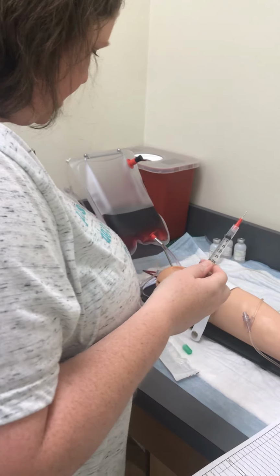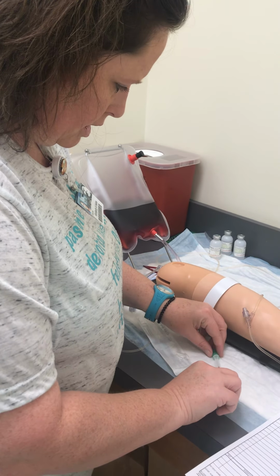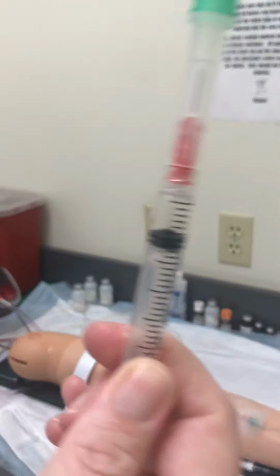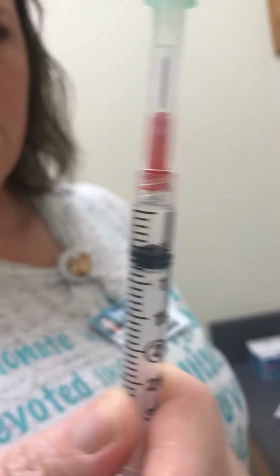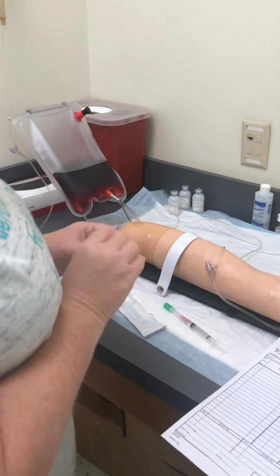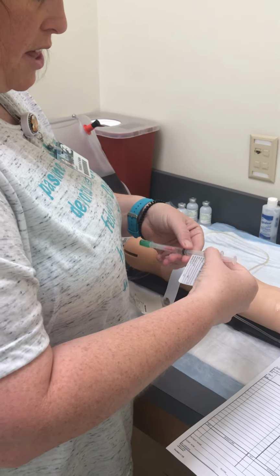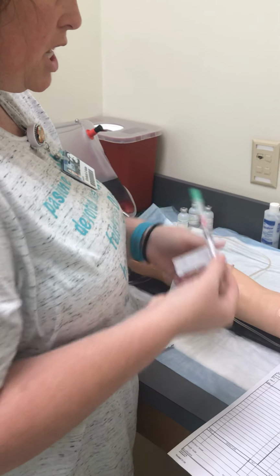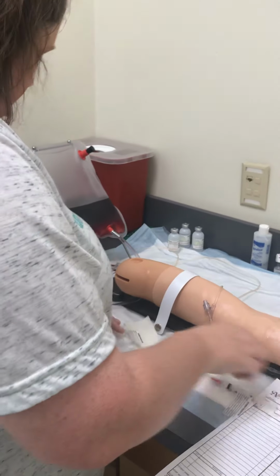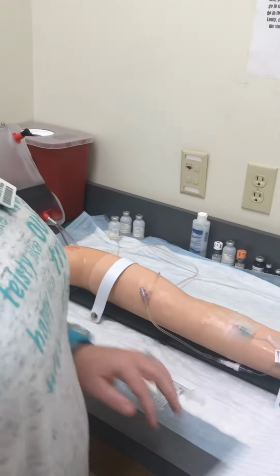Okay. And I'm going to recap. And I'm going to verify I got a 0.6. Before I leave the med room, I'm going to take my sticker. Now I'm going to put my patient's name on here, the medication, morphine, the amount 0.6, the day I prepared it, and the time. Okay, now I'm going to go to my patient's room. I'm going to take my MAR with me.